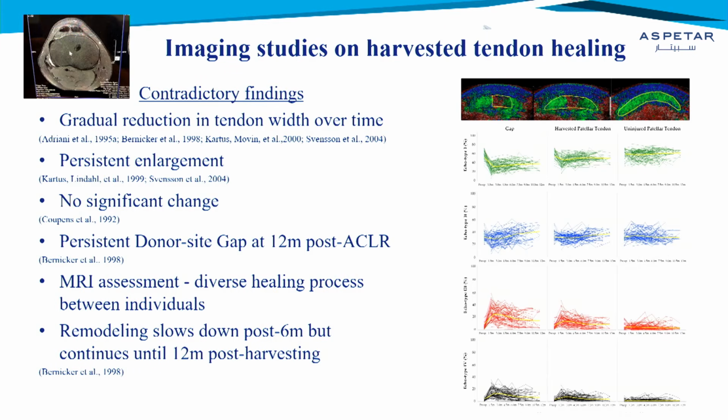In this image here, we can see the trajectory of all the 62 patients. And if you look closely, you see that there are some people who finished with nearly nothing of echotype 3 and 4, and had very good tendon distribution for echotype 1 and 2, and others were going high in the negative echotypes.